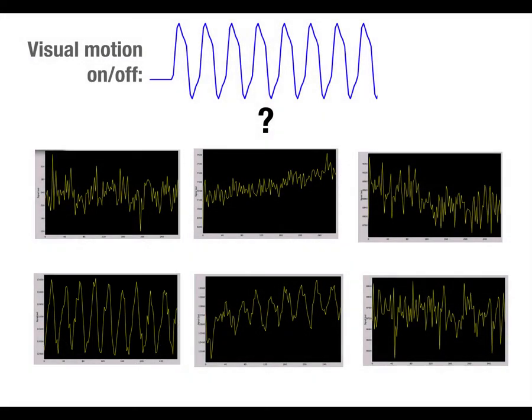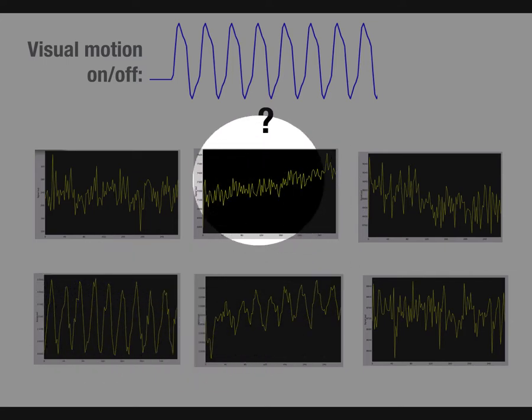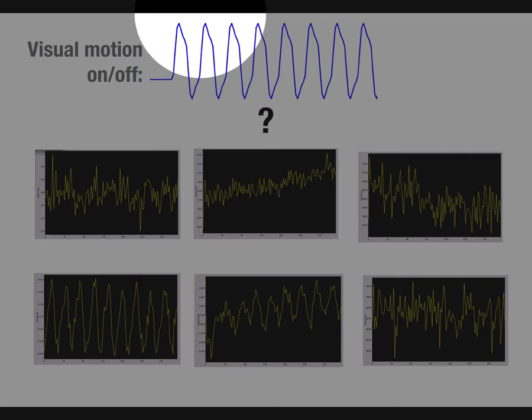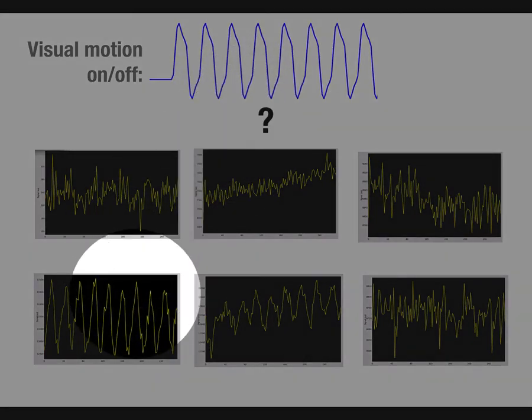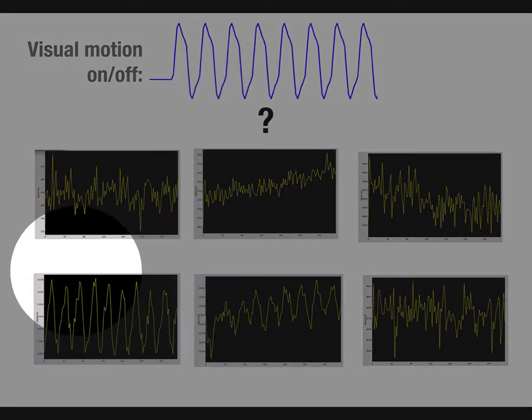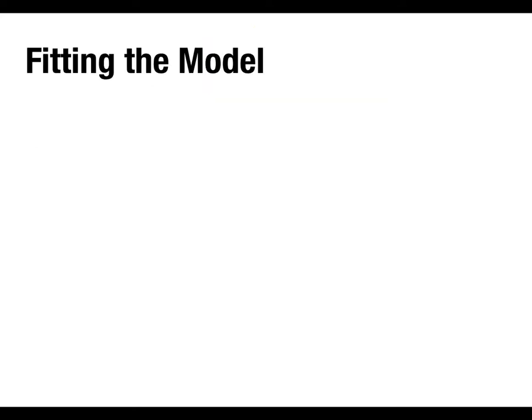And this was visual motion, moving dots versus static dots, so it's a really good driver of activation in V5, motion-sensitive cortex. And I knew where to look, so I sort of fished around and found some very clear ones. But the question is, which other ones might have something of that pattern, because always we've got some level of noise. And in a lot of experiments, you don't find any brain areas that show something that's that clear-cut, because you've got tighter contrasts or more complex kind of designs.